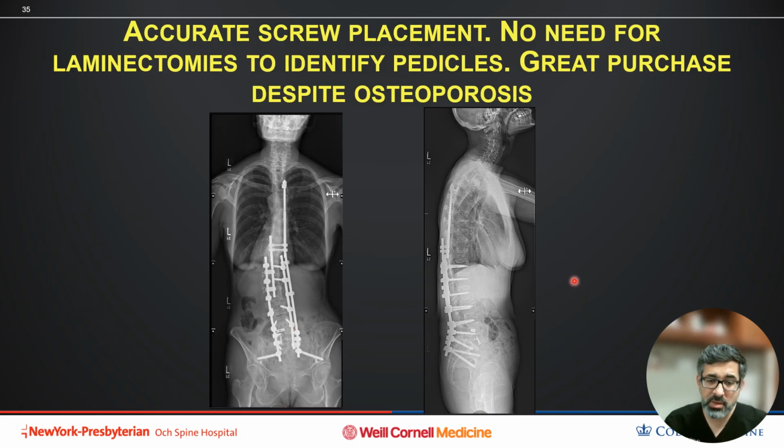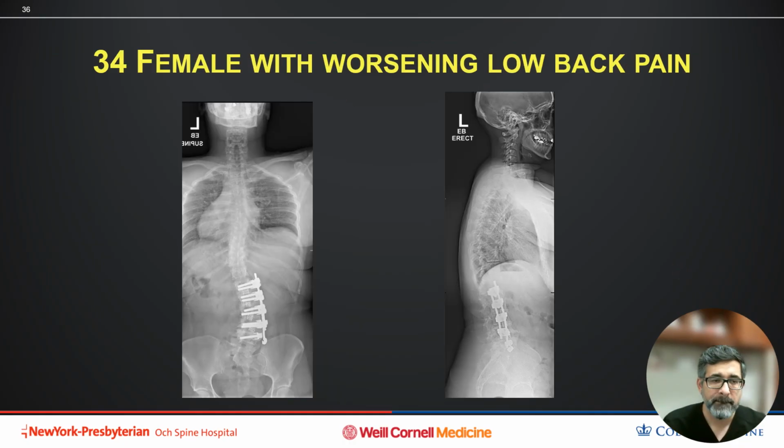Really good purchase of these screws, even in patients who have osteoporosis, because you are not doing multiple passes. You are doing a very precise one pass. We're putting in a big diameter long screw. So even in osteoporotic patients, you can get good purchase using very specific planning.